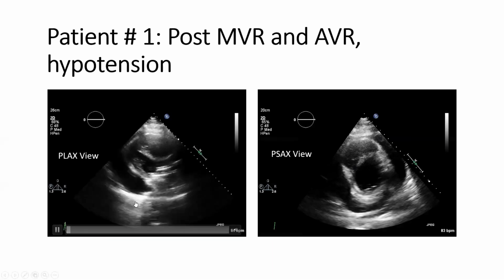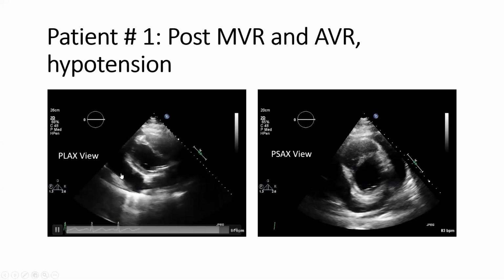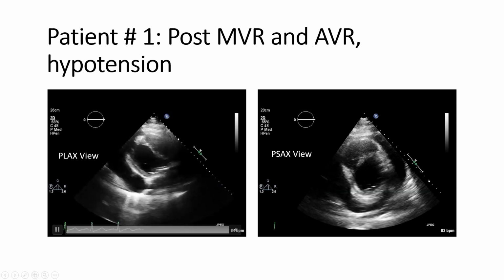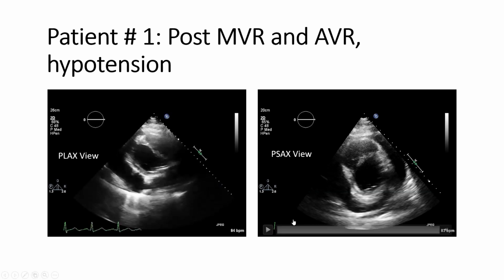So here is a parasternal long axis view. It is pretty obvious that there is a posterior fluid space. You don't see the aorta too well. There is no or very little anterior fluid space, the RV is dilated, and you clearly see that the layers of pericardium, the parietal and visceral, where my pointer is, hopefully you can still see it, they move together, suggesting that there is a little bit of adhesion, which is not surprising considering the fact that this is a post-cardiac surgery patient.